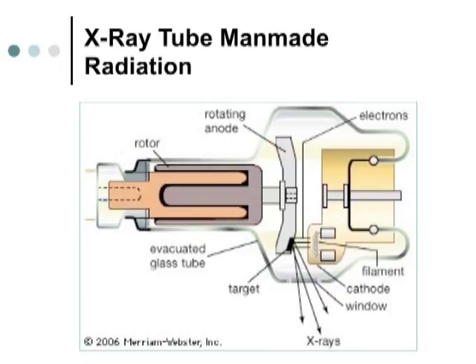Now, as I said before, this process isn't very efficient. 99% of the energy is heat. About 1% of the energy is actual X-ray production. So this is a typical X-ray tube, just the parts of it. The anode itself rotates, it spins at about 4,000 RPM because you have to dissipate the heat somehow. You can have stationary anodes, but they don't last as long. So most high heat capacity tubes spin. And then this is the cathode where the filament is.